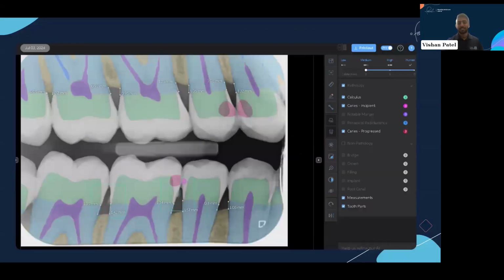So here you can see it's correctly diagnosed that you've got upper right 4-5 caries. It's also said that there's an enamel lesion, but did anyone spot the lower right 6 mesial decay? On this Pearl view, it's obviously brought my attention to this lower right 6 area.